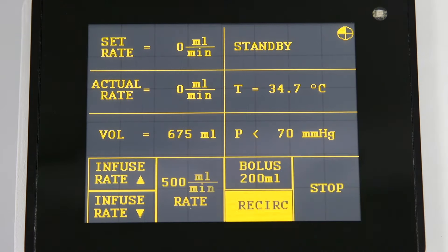Pressing the recirculation key will recirculate fluid through the reservoir and disposable circuit. This feature is used to warm and mix fluids and will automatically stop after five minutes.